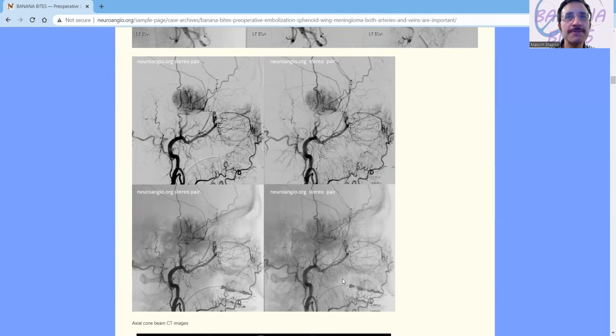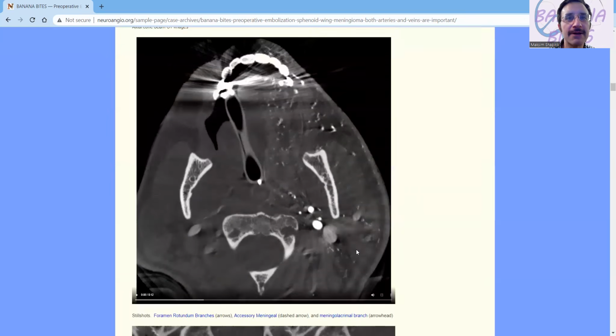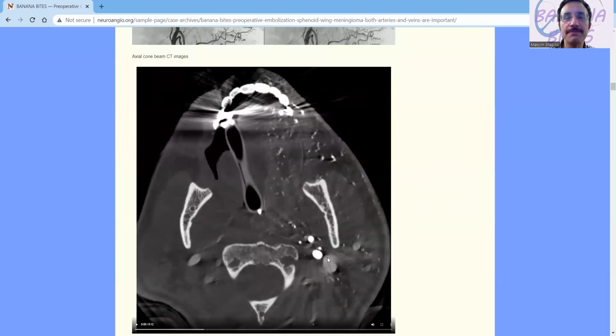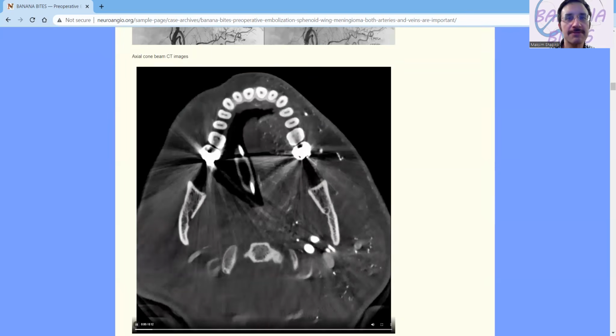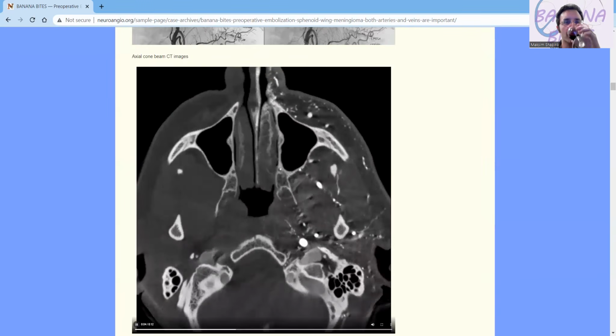anatomical background image. What do we see here? Now, if you know your anatomy, you appreciate that there's a branch right here that supplies this tumor from the IMAX. Now, I'm going to, of course, give this branch a name, but you can appreciate that too. Now, of course, we do the cone beam CT. It's important to look at the source data, so we can just play this along and bear with us.